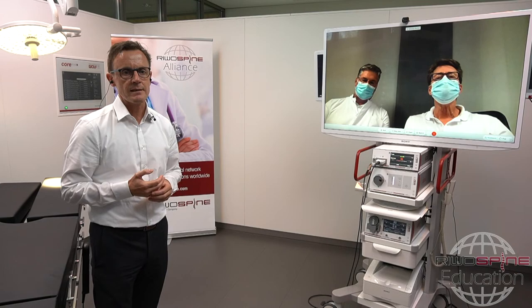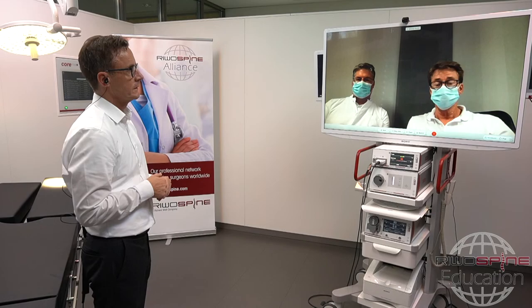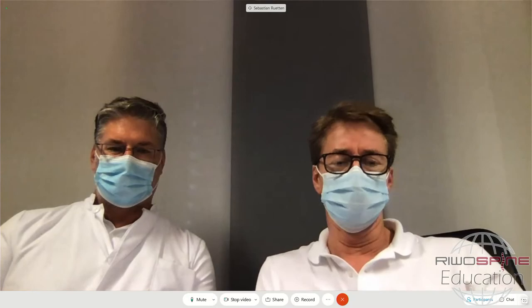Another question, Dr. Rutten: what is the incidence of dural injuries for the cervical applications here? In cervical endoscopic surgery it is less than 1%. Normally, dural injury in cervical spine surgery from posterior is not a problem. We don't see that normally.